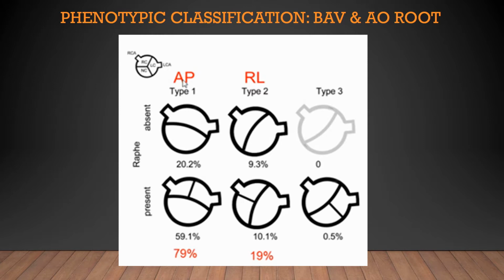This is important for us to understand because a lot of times the way you will be planning your therapy with a percutaneous aortic valve replacement would depend on the size of the sinuses, the way the leaflets are oriented, where the coronaries are coming from, what is the size of the sinuses, what is the issue with closure of coronaries as the leaflets stand up as you implant a percutaneous heart valve.